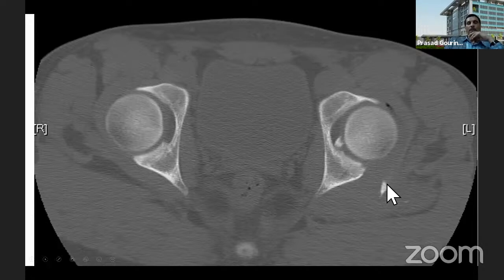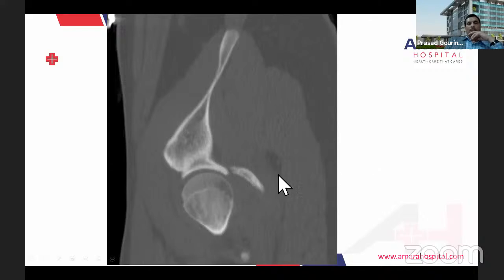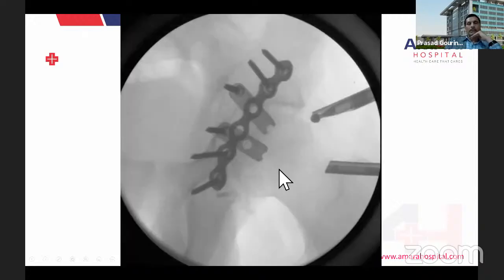The posterior wall piece was pretty thin and long, but based on the deficiency I saw preoperatively, the long thin piece. So I went posterior, took the piece out, and put that piece back together, hoping that the posterior deficiency will be mitigated with the intact capsule and putting the wall back together. And we also repaired the labrum way down below with an anchor.